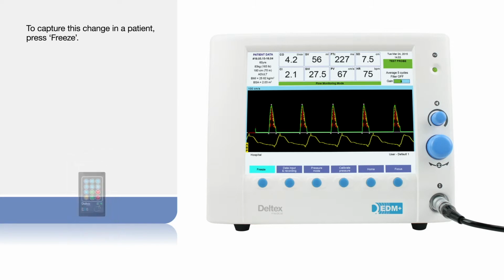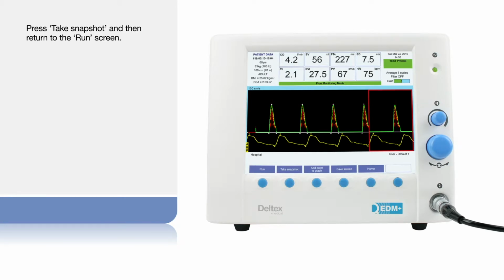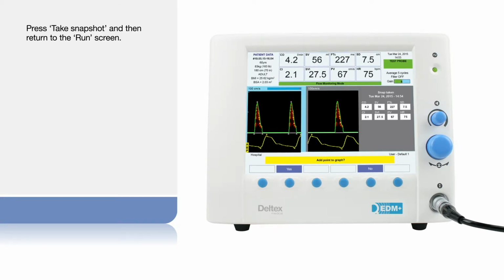To capture this change in a patient, press Freeze and center the red window over the waveform. Press Take Snapshot, add a point to the graph, and then return to the Run screen.